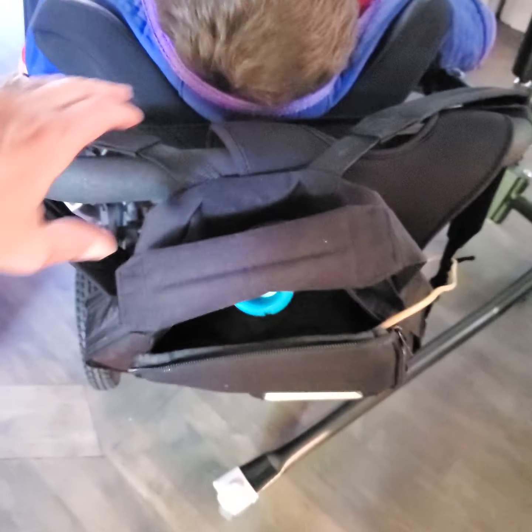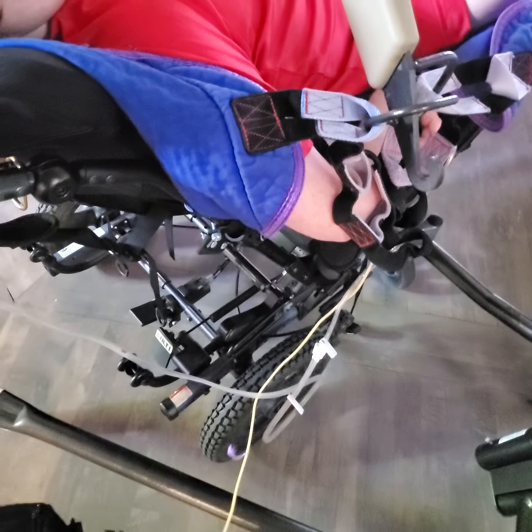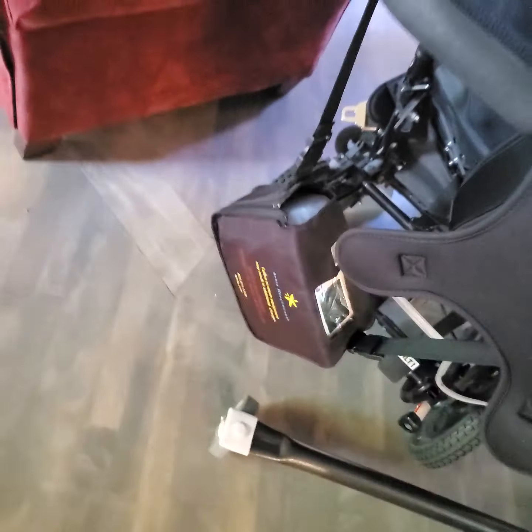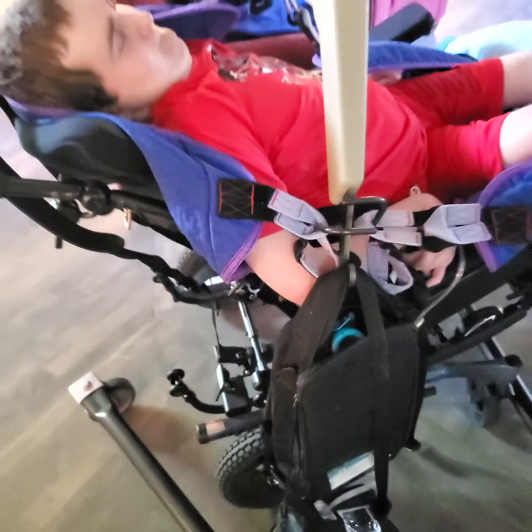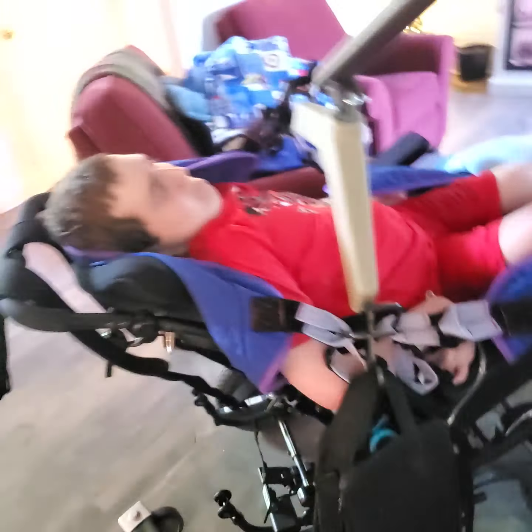Okay, the other thing you want to make sure is that Jack's head has some of the sling behind it. And then we have to take his feeding bag, which is on the back of his chair, take it off and hook it on this outside hook right here. All right. And then we will take his wound vac, which is also on the back of his chair, and hook that to the same hook. So now we've got both items hooked. Jack is hooked up to the Hoyer.